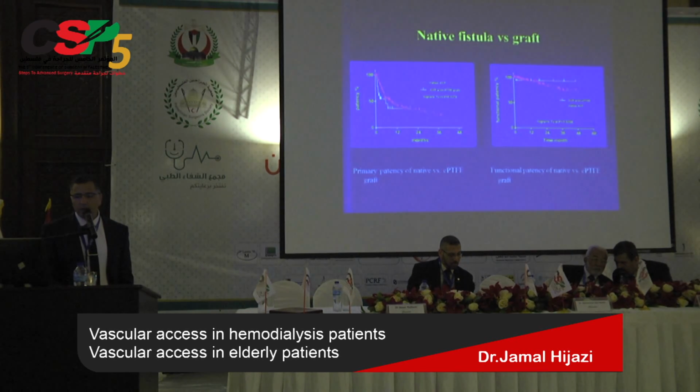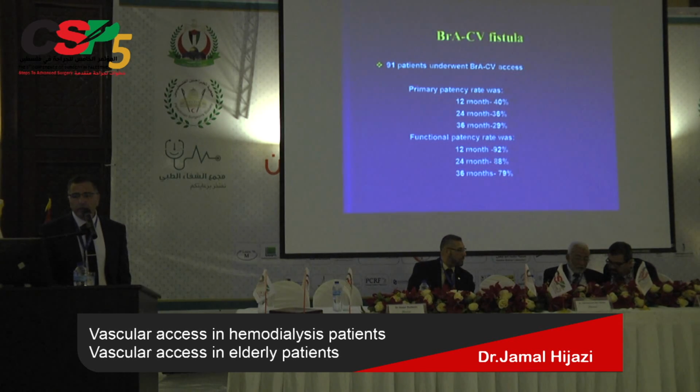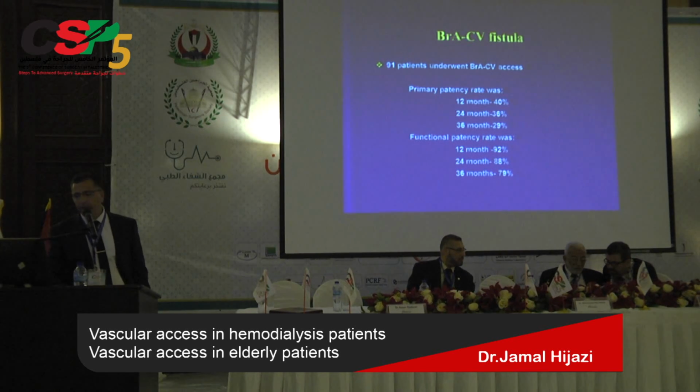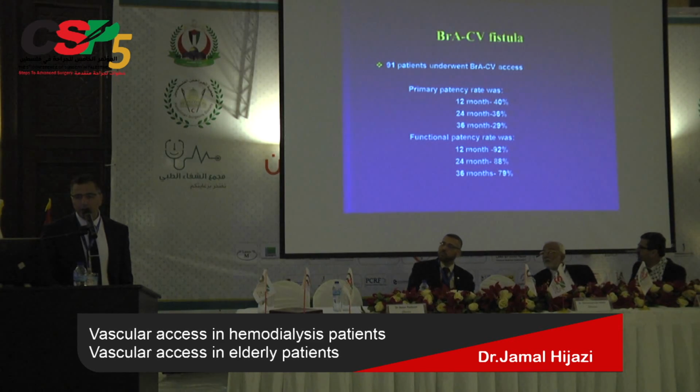We noticed that there is no statistical difference between the primary patency and secondary patency for all types, for native fistula and also graft. For brachiocephalic fistula, we created 91. The primary patency was 40% at 12 months and 92% as functional patency after 12 months.